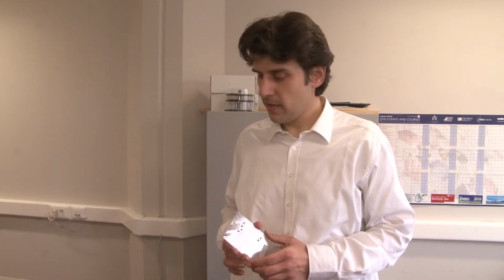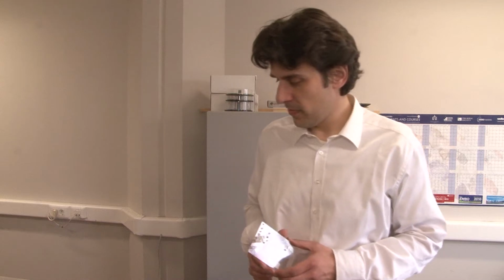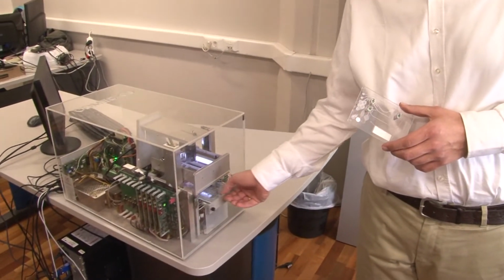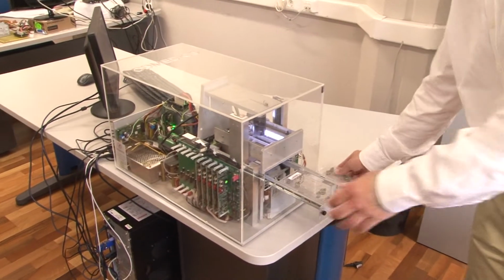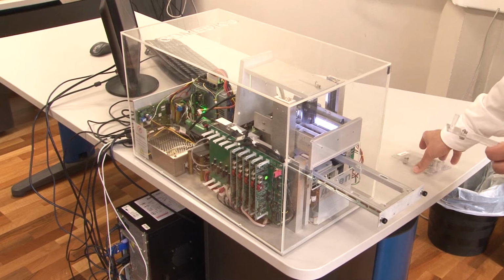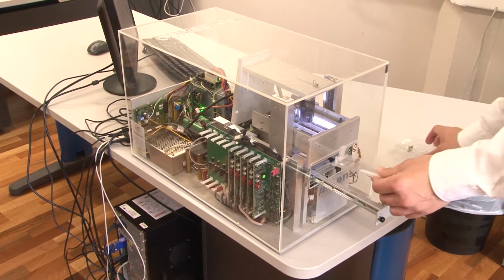The CDMedics instrument is used for two different chips. One that is performing a serological analysis, antibody detection, and one that is performing genetic analysis. Both chips fit into the same slot, and the machine can adjust its execution to each of the slots automatically. Both chips have the same footprint.